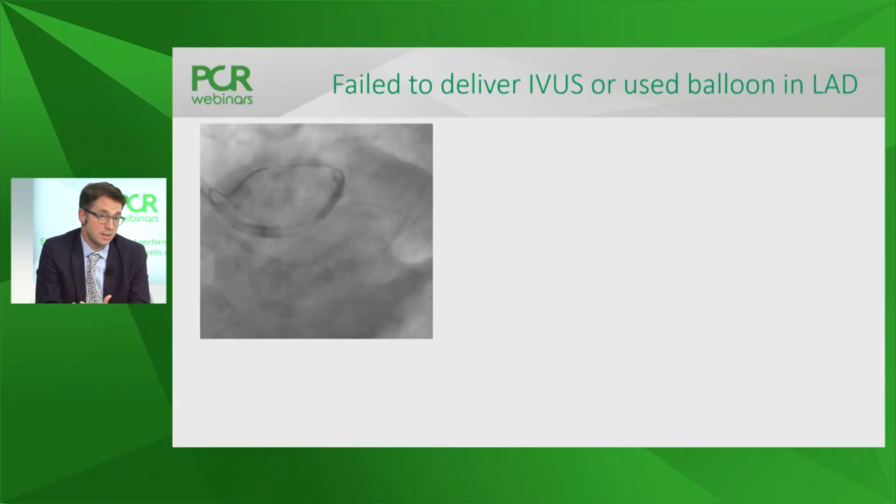So Tom, let's apply in your case all these steps, trying to comment and explain why you did something. We saw a lot of calcium, so lesion preparation is necessary. Is it possible to start such intervention by ballooning the lesion and perform rotablation in case of failure only? Yeah, so clearly we have had to predilate this lesion already, in view of the fact it was closed at the very beginning of the procedure. So we've dilated the lesion.